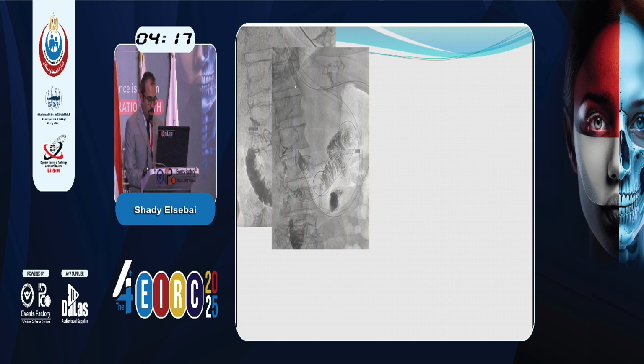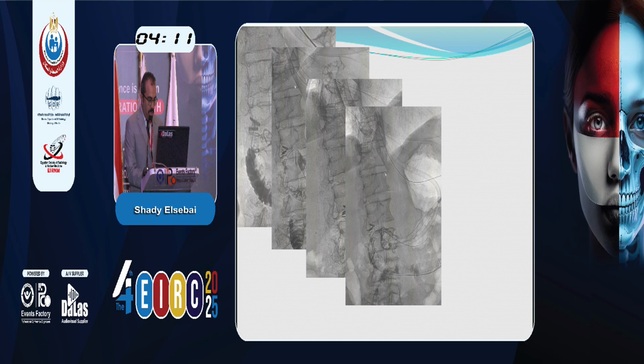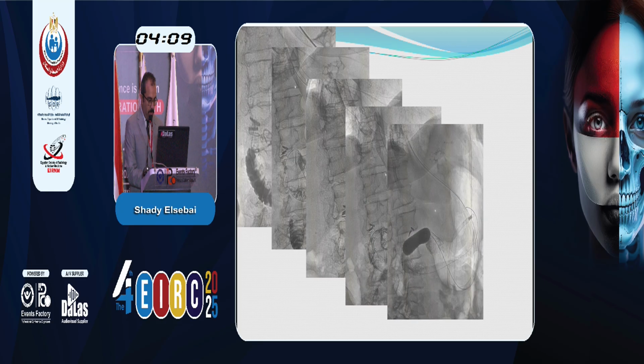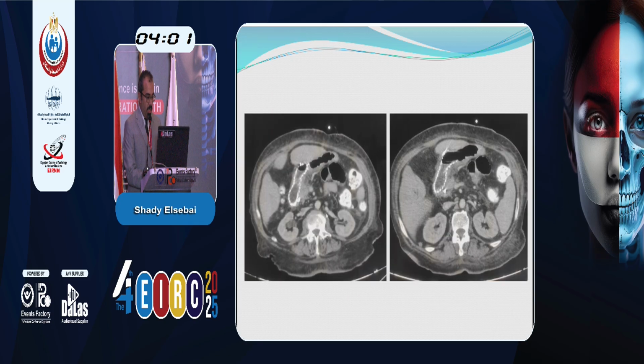Then a guide wire is used to pass through the stricture, followed by stent placement, deflation, and balloon dilatation, and the final imaging to see free flow of the contrast through the stomach. This is the CT image of the same patient at 3 months follow-up, showing the stent in place, patent, with average size of the stomach and no evidence of distension.